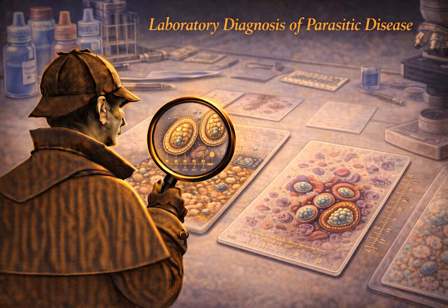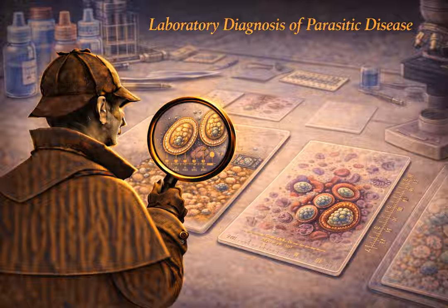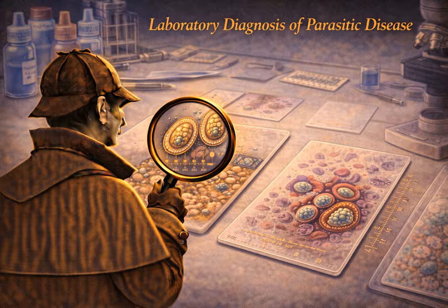Are they inside the red blood cells too? No. Trypanosomes, which cause Chagas disease in the Americas or African sleeping sickness, are extracellular blood parasites. You do not look inside the red cell, you look in the plasma space right between them. They are large, very distinct worm-like structures with a long, undulating membrane and a flagellum, literally swimming freely through the plasma. In a fresh, wet mount of blood, you can actually see them violently thrashing around, bumping into the red blood cells. They're pretty hard to miss if you're actually looking for them.